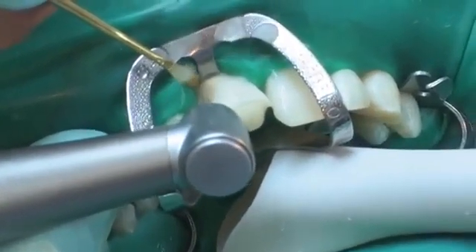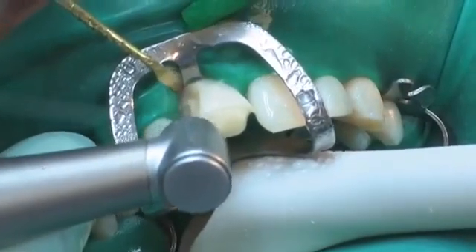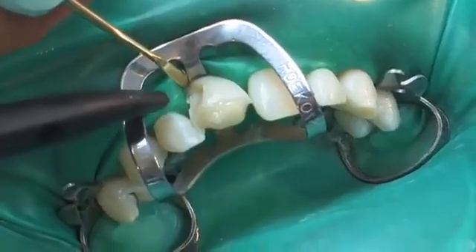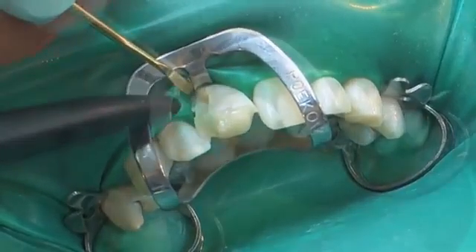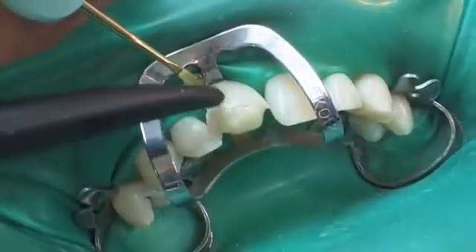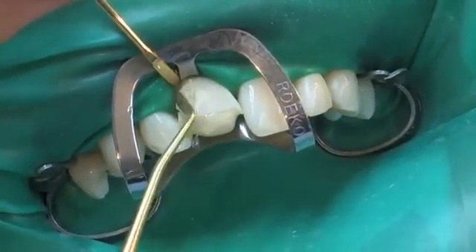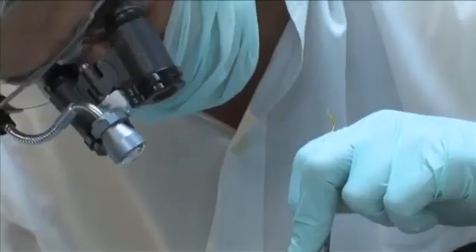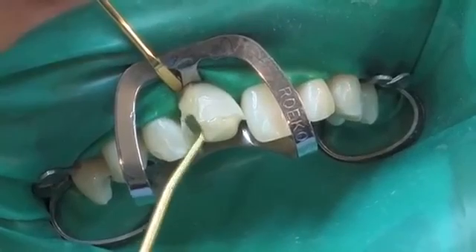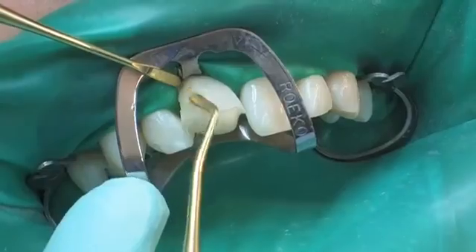The defect on the cervical margin is prepared using rotary instrumentation while preserving as much tooth structure as possible. A self-conditioning single bottle bond is ideally suited for placing small composite restorations in this manner. A small increment of composite is applied, sculpted and polymerised.